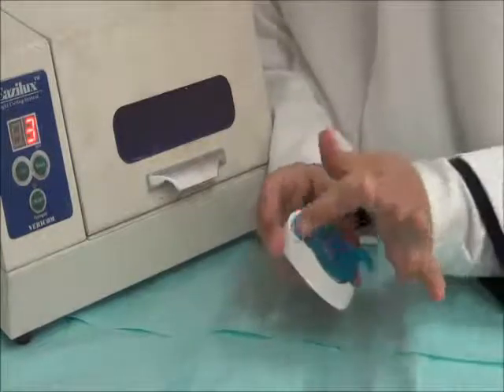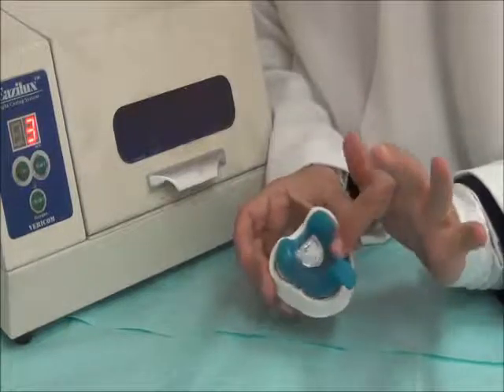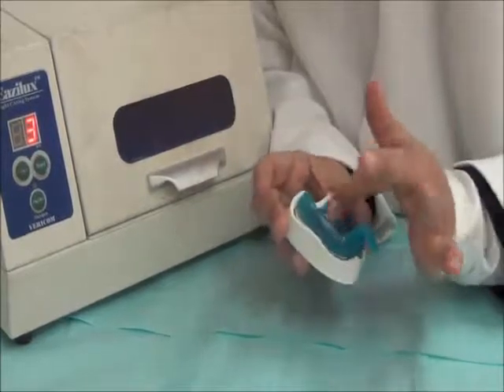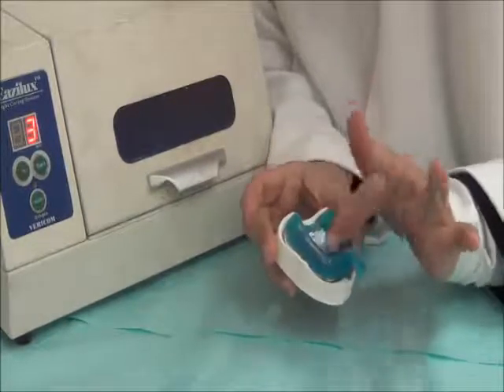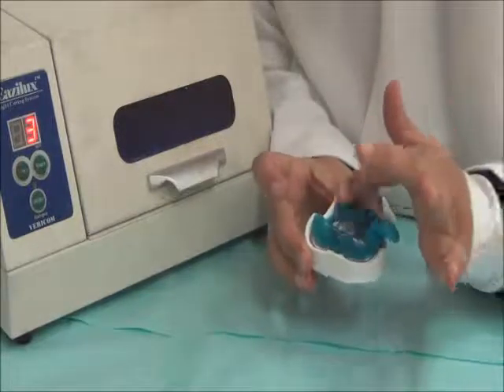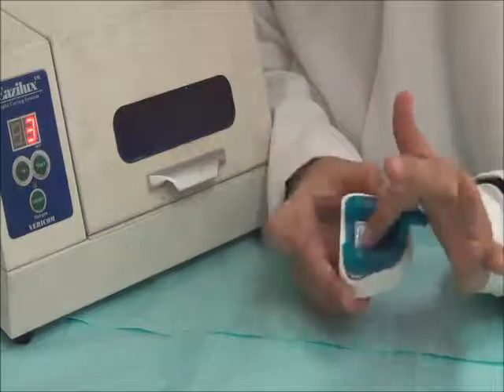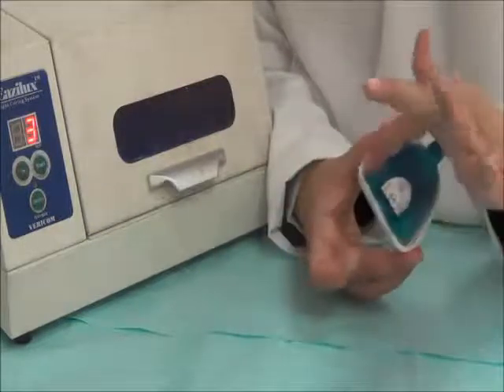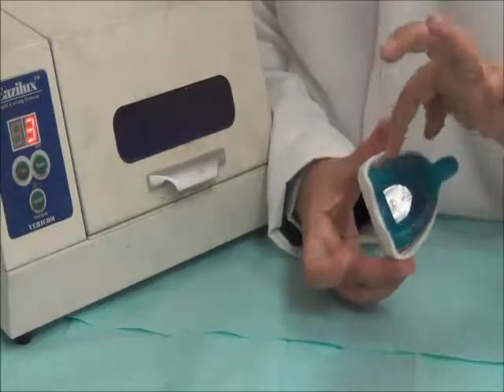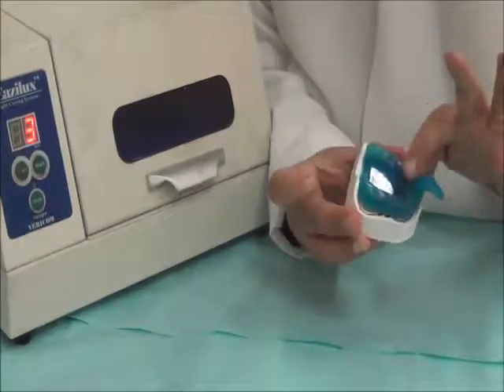So using Vaseline, it will smoothen the surface, it will aid in the adaptation of the handle to the body of the tray, and it will reduce or prevent the air inhibited layer. So once the material sets, we will not have the tacky part on the surface. And we have here the opaque layer. This will reduce the shrinkage in the palatal area, and it is fully adapted from all sides.